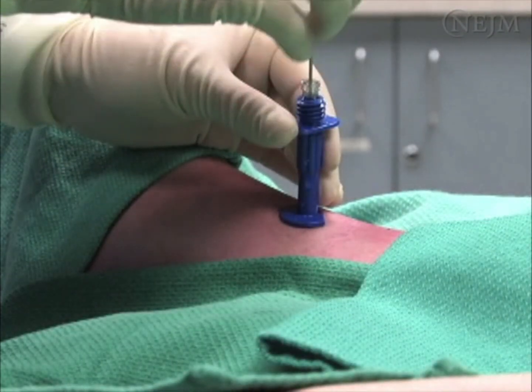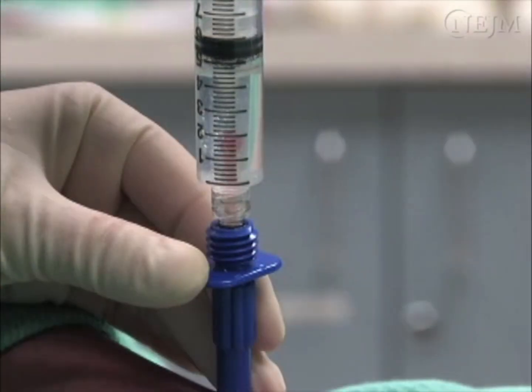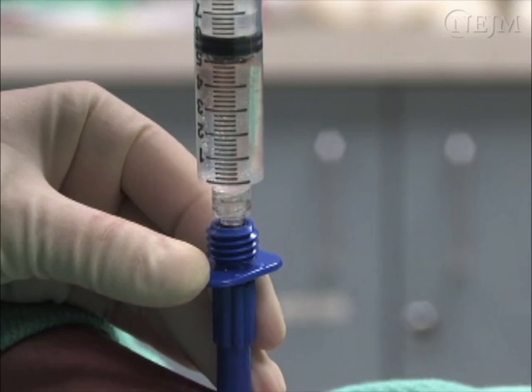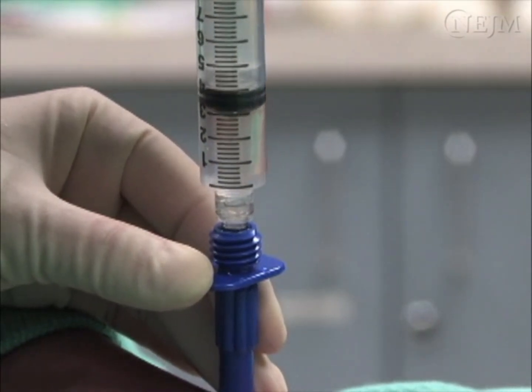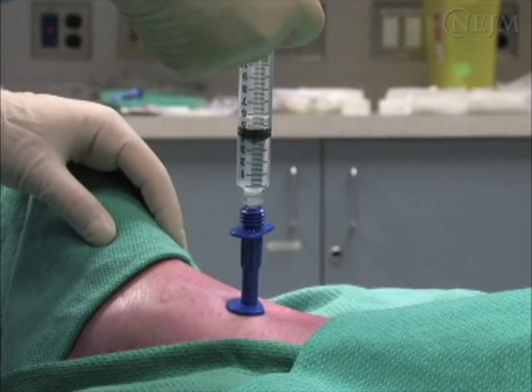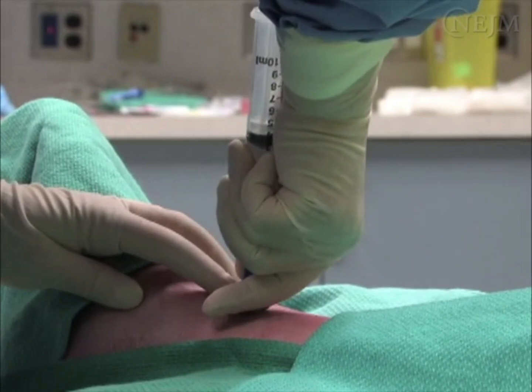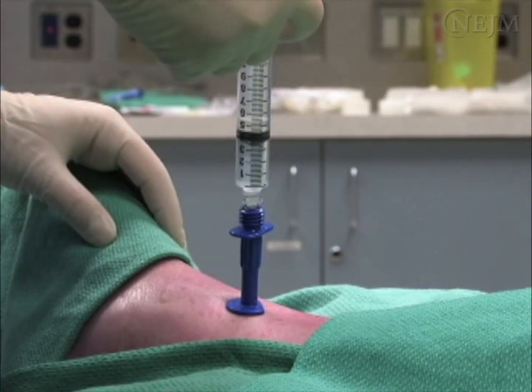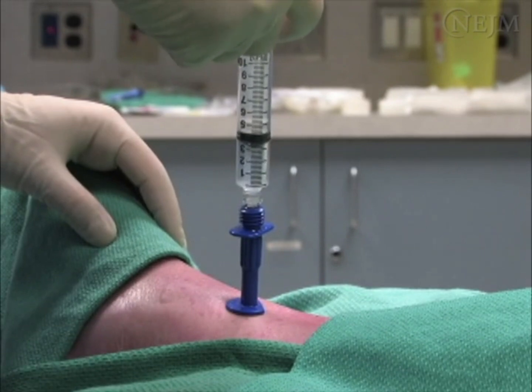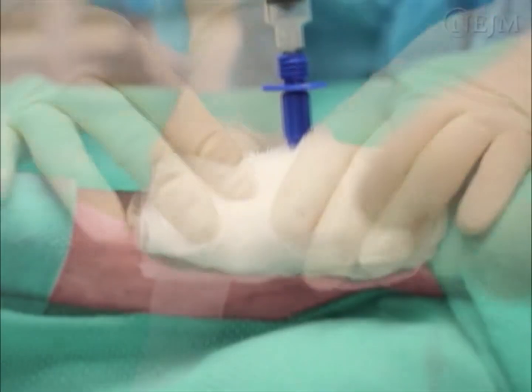Remove the stylet and connect a 5 cc or 10 cc syringe to the needle. Obtain confirmation of placement by infusing a 10 cc bolus of saline solution through the syringe. The fluid should flow easily with no resistance. If the fluid does not flow easily, the needle can be repositioned by pulling back slightly, but if further resistance is encountered, the needle should be removed and a new site selected. Secure the needle with bulky gauze dressing and tape.